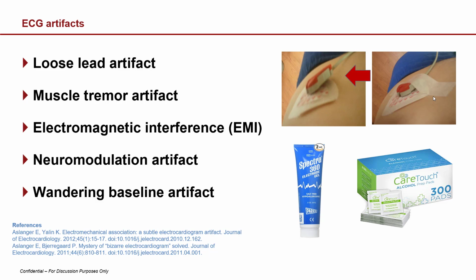Now, some patients come in and they've got a lot of lotion, or some patients are post-operative and they're diaphoretic, and the stickers won't stay on them. So you might want to clean the skin. You could use a 2x2 gauze pad. You could also use an alcohol wipe. If the patient's got a lot of dirt on their skin, the alcohol wipe works really well. Sometimes you can lose conductivity because you're losing all of the moisture. To solve that, you can use some ultrasound gel right under the metallic component. Just a tiny bit will work very well there.